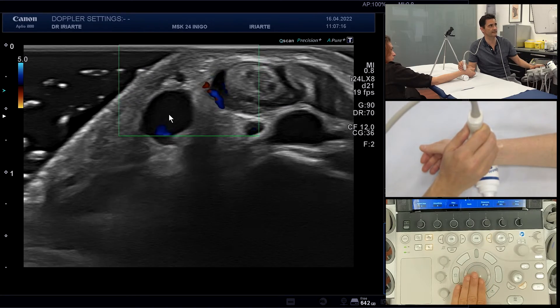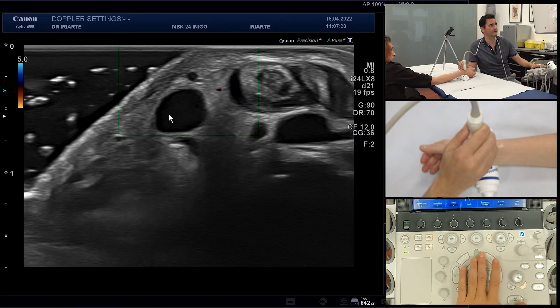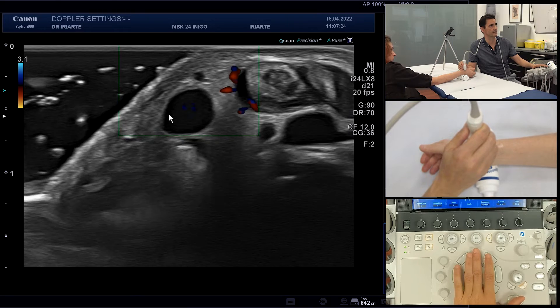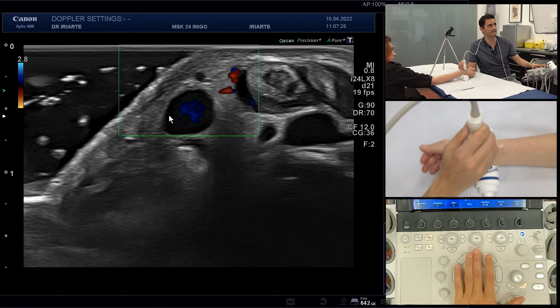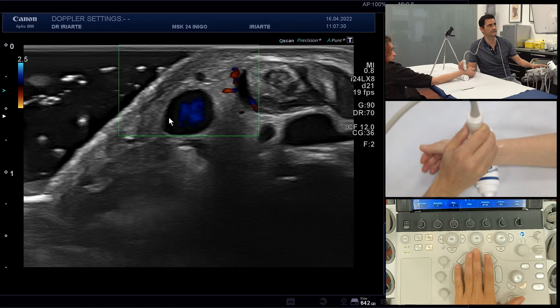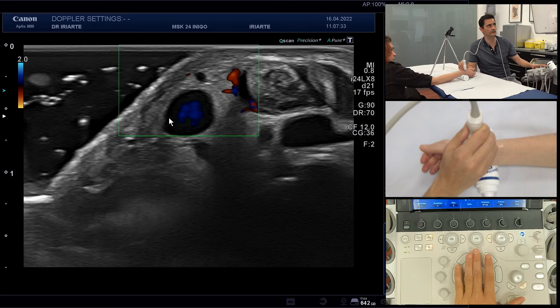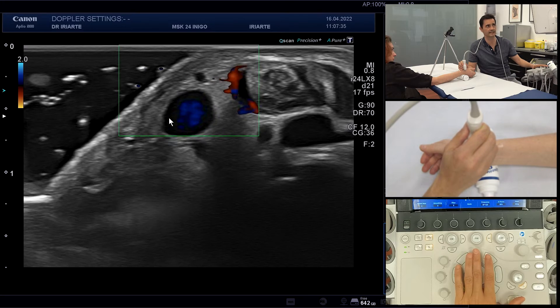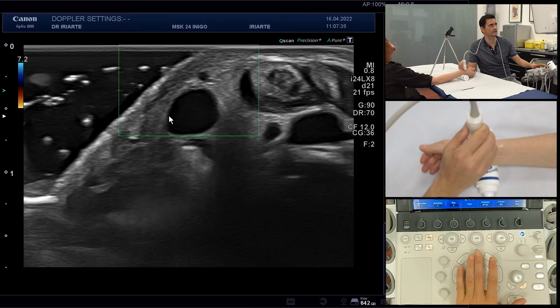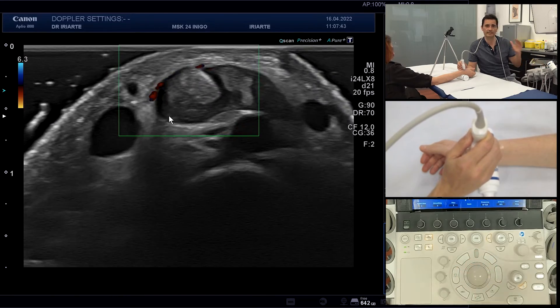Take a look at this vein here. We have a PRF of five, and now we are going to decrease the PRF. Since veins have a very slow flow, we need to decrease the PRF to have a view of the flow inside the veins. Now let's go back to six.